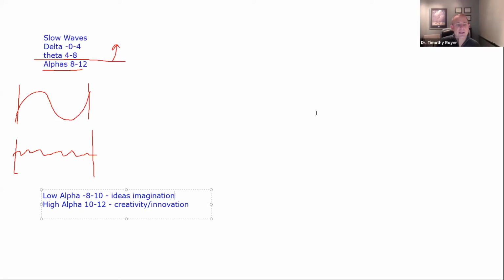Let's go ahead. We talked about the slow waves, the alphas, the thetas, and the deltas. Now we're going to talk about the perfect brain waves, which are called SMR. So now we're going to talk about SMR and what's called low beta.